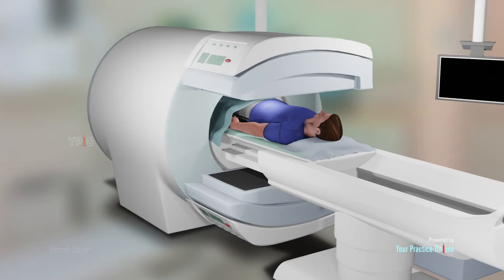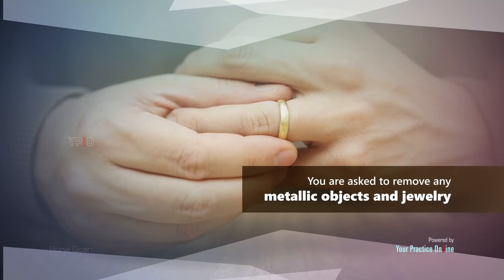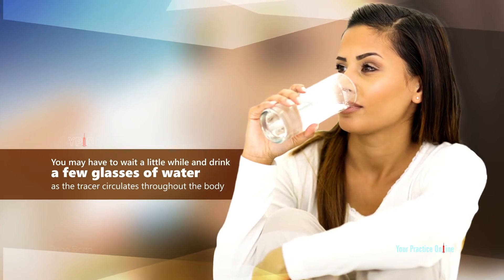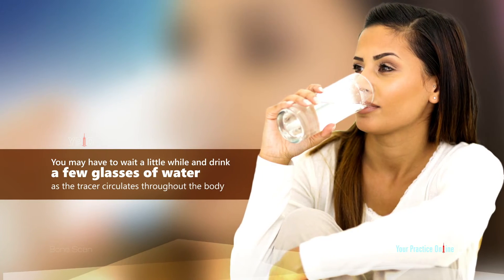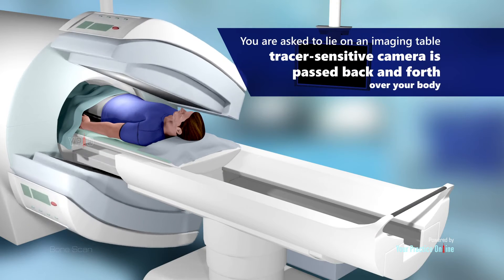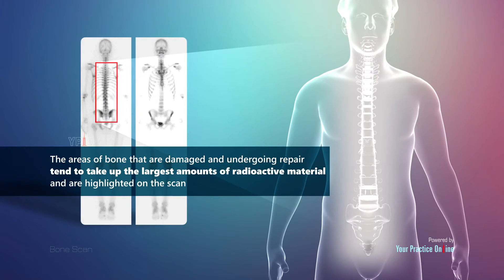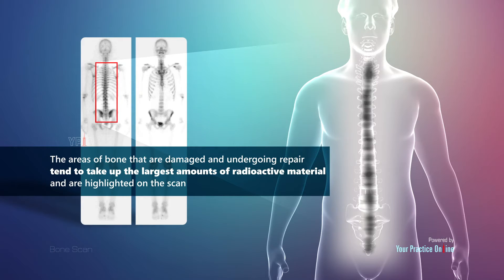The bone scan procedure involves the following steps: You are asked to remove any metallic objects and jewelry. A tiny amount of radioactive tracer is injected into your vein. You may have to wait a little while and drink a few glasses of water as the tracer circulates throughout the body. After enough time has elapsed, you are asked to lie on an imaging table and a tracer-sensitive camera is passed back and forth over your body. The areas of bone that are damaged and undergoing repair tend to take up the largest amounts of radioactive material and are highlighted on the scan.